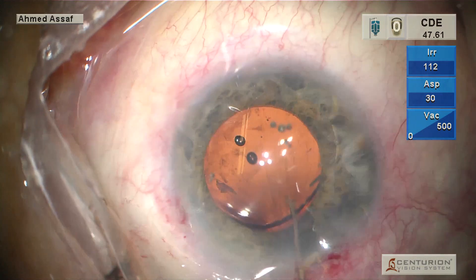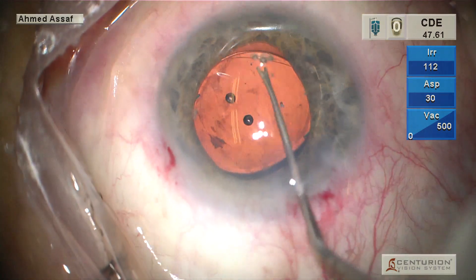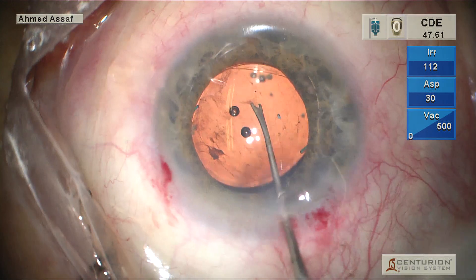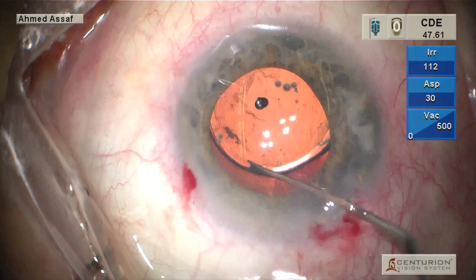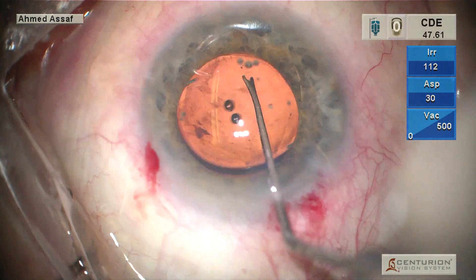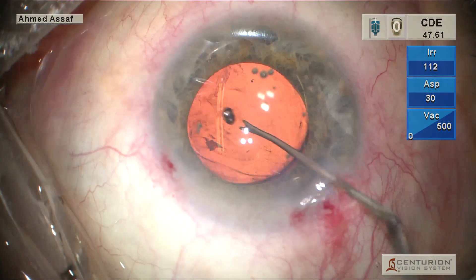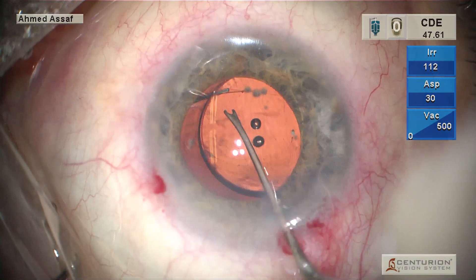The step that I always like is to do the optic capture. As you can see now, the lens is above the rhexis. What I'm going to do is to push the optic behind the rhexis — one part, and this is the other side. Now we have a successful optic capture.